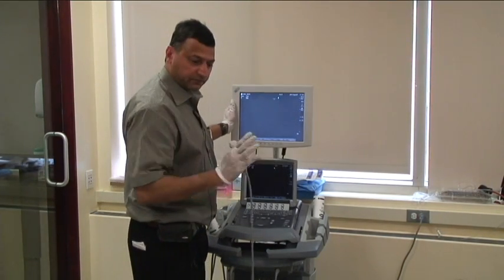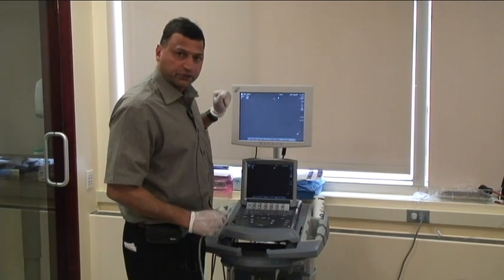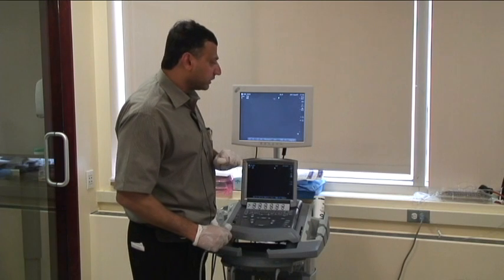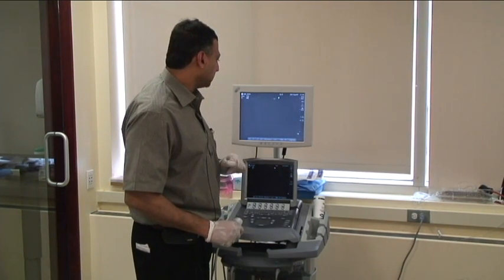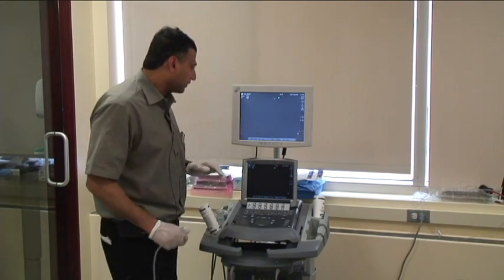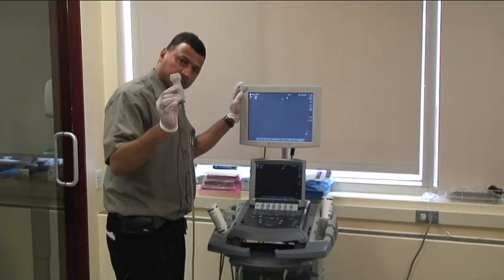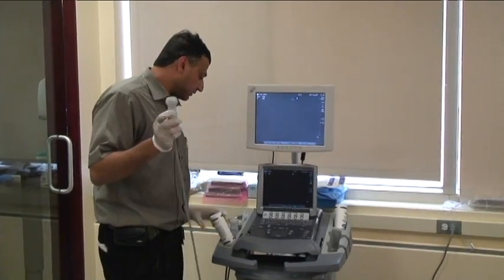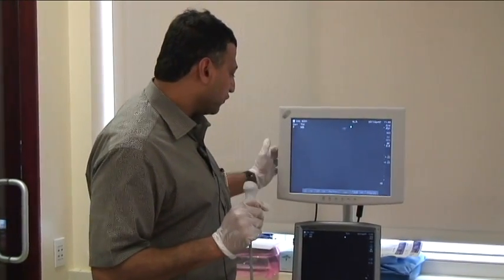Sometimes I've realized that I've started doing my ultrasound exam and nobody's charged it up. So make sure either you are fully charged up, your battery's full, or you're plugged in, and you don't want to be interrupted in the middle of an exam. Have it on cardiac mode here. We have the low frequency probe, 2 to 4 megahertz. That's what we use for cardiac exams, abdominal exams, and so on and so forth.